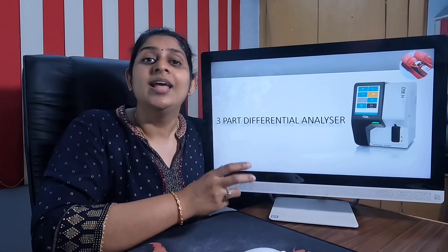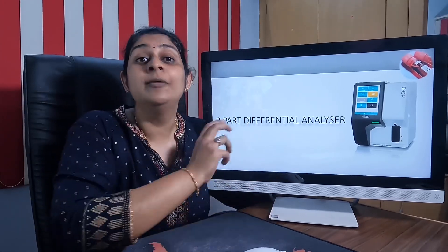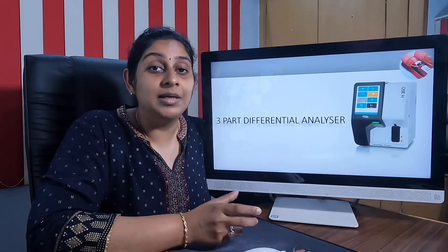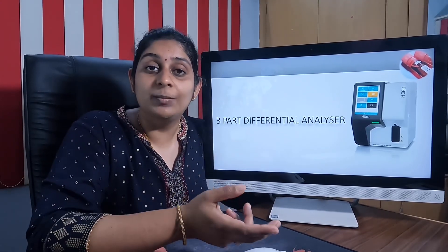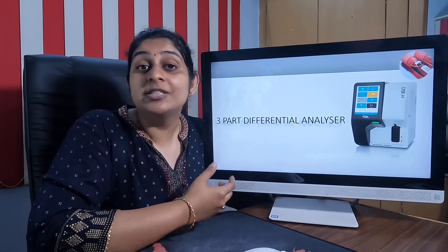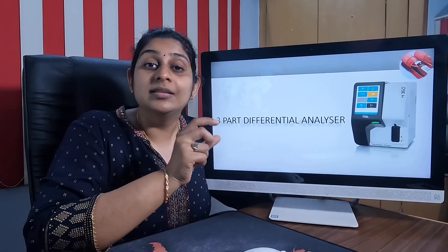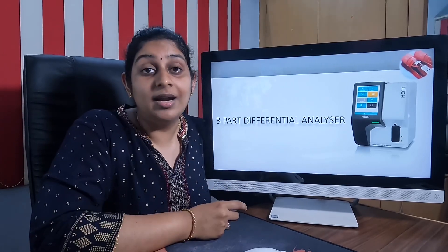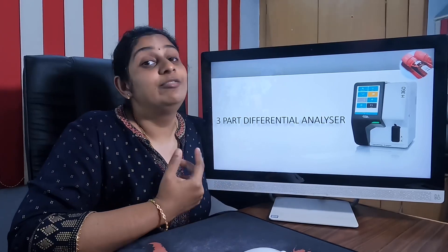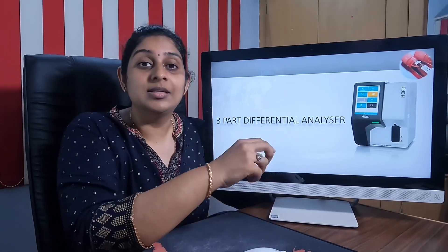In the WBC, there are five types of white blood cells. In this three-part analyzer, you will get three parameters: neutrophils, lymphocytes, and the other three WBC types — eosinophils, basophils, and monocytes — reported as a single mixed cell component. This is the main distinction between a three-part and a five-part hematology analyzer.